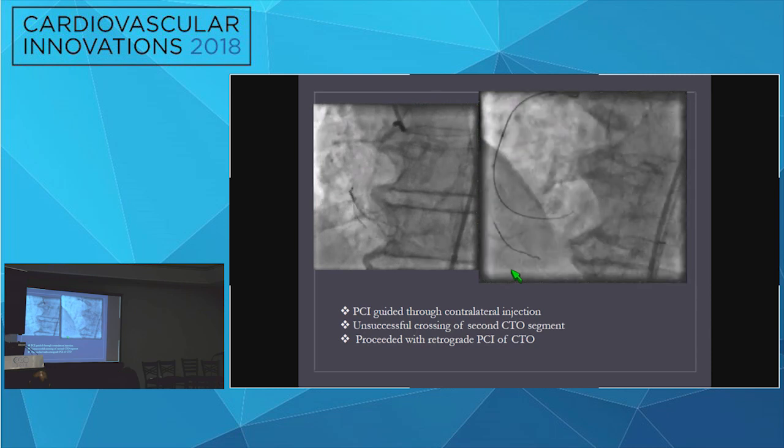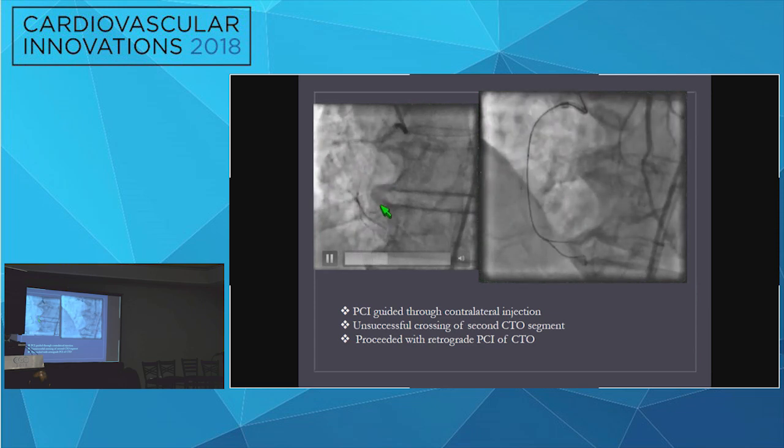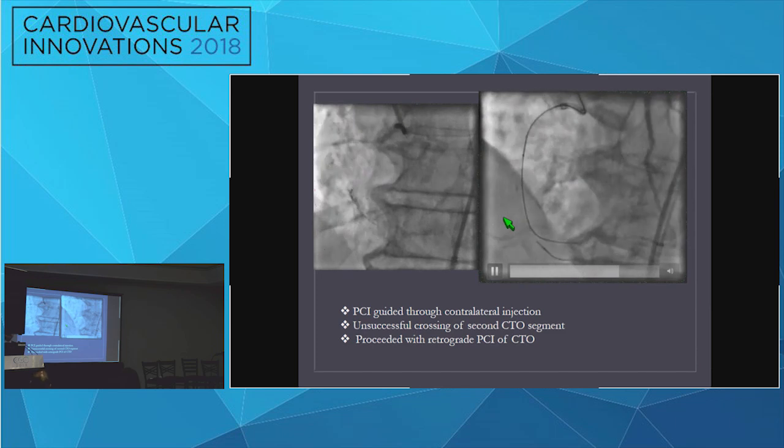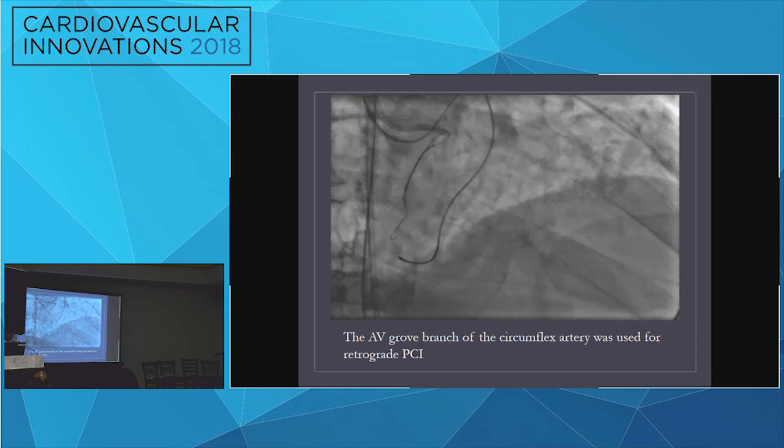Yep. So we used Pilot 200. We were able to cross the more proximal occlusion right here, but the whole system kept selecting this acute marginal. So I advanced a balloon trying to obstruct it, and then tried with a Progress wire and Confianza Pro 12 to cross into the distal RCA, but this didn't work. So we advanced a Pilot 50 wire supported with a Corsair.